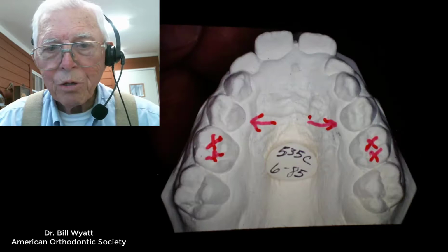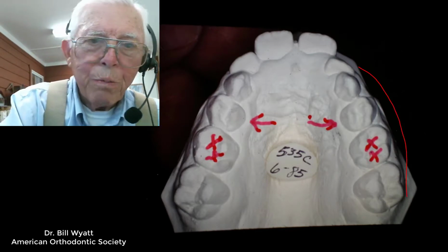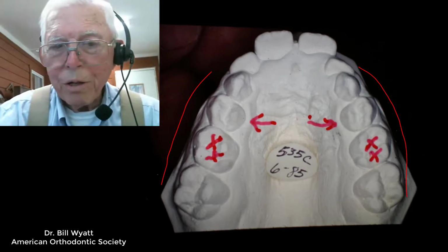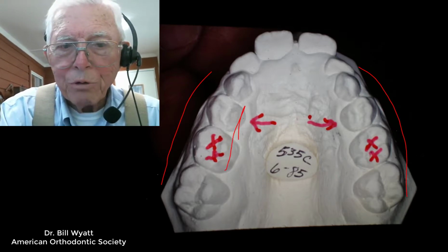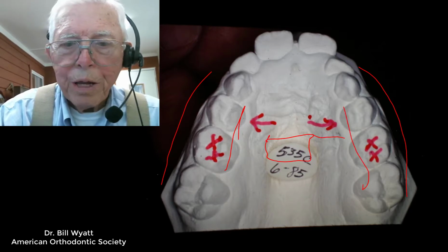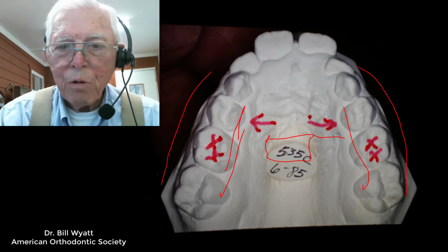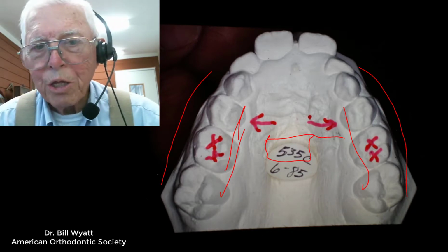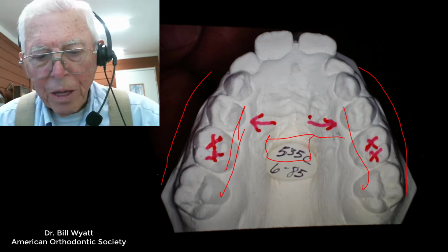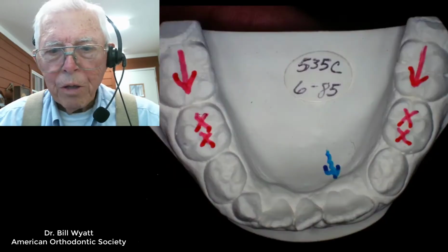So let me get through this. You see the upper arch is spread out here. We're going to put a palatal separator in here and spread this upper arch out with that palatal separator, even while he's got the deciduous teeth in the mouth. And you can follow this. This is a good example of this.